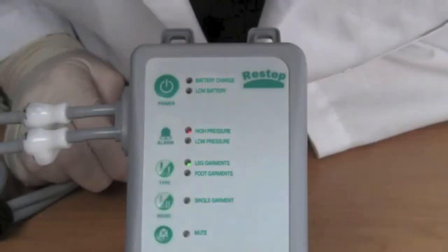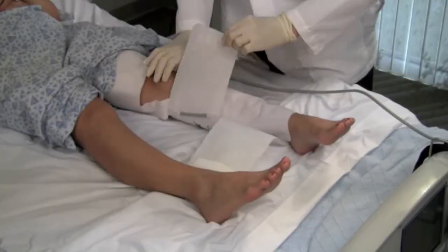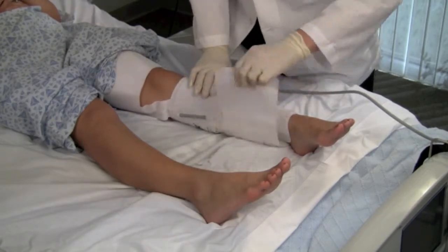The high pressure alarm is a solid red light with an audible alarm indicating high pressure or kinked tubing. A solid red light with a beeping audible alarm indicates the garment is not deflating properly. Check to ensure that the tube set is not kinked, bent, or blocked, and replace the garment as needed.